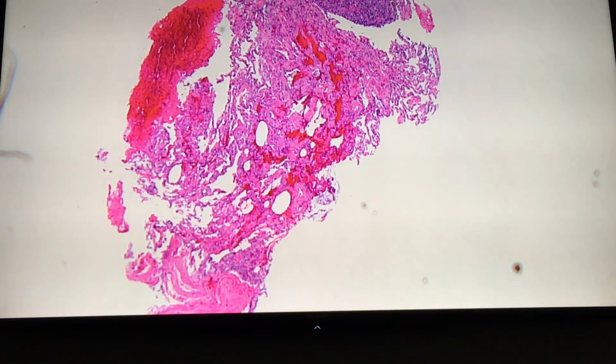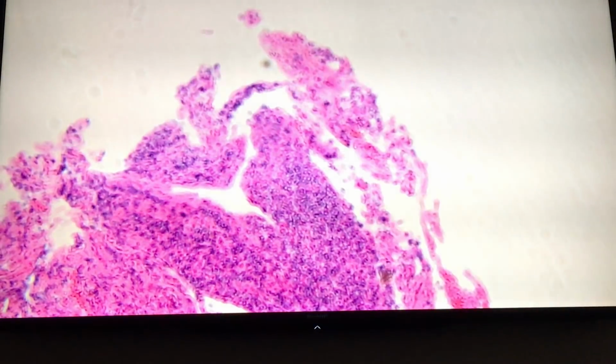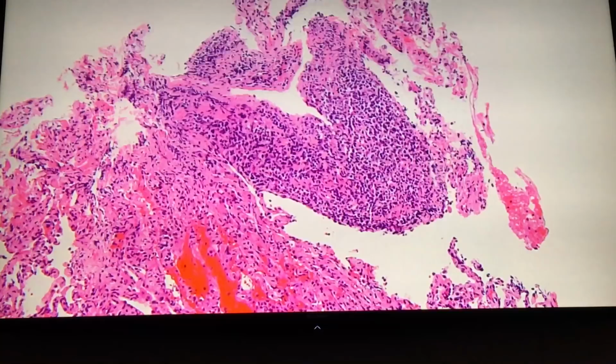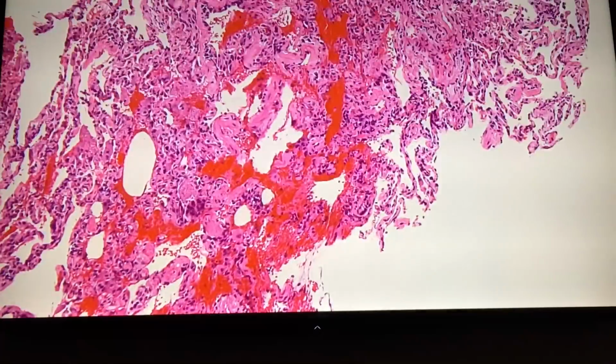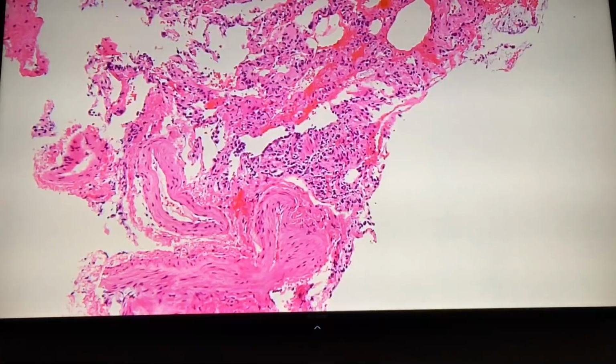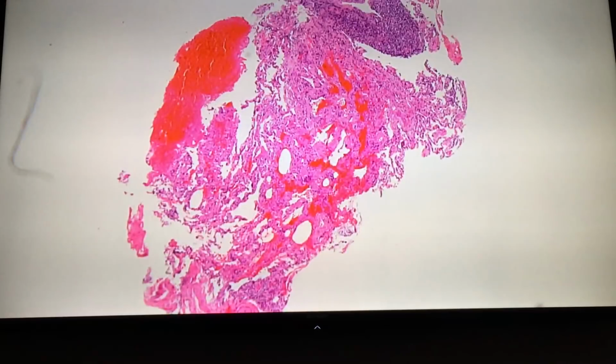Transbronchial biopsy. Perfect, Frido. I'll give you points just for transbronchial. Inflammation. Chronic inflammation. You guys are doing great so far. And I will tell you, there is actually a diagnostic finding right in this biopsy, right in this fragment.